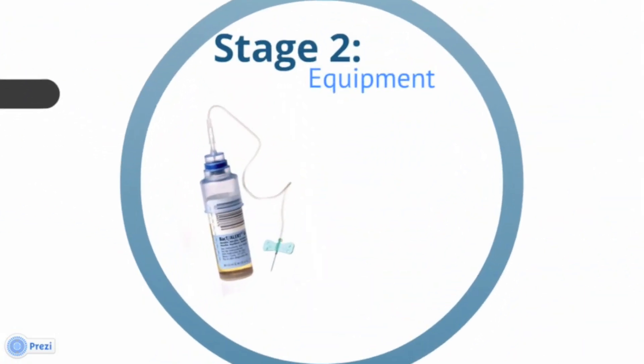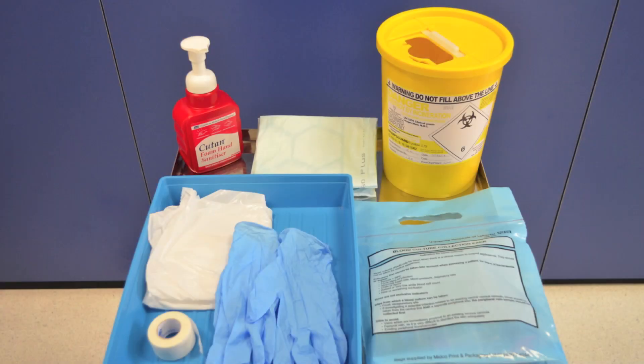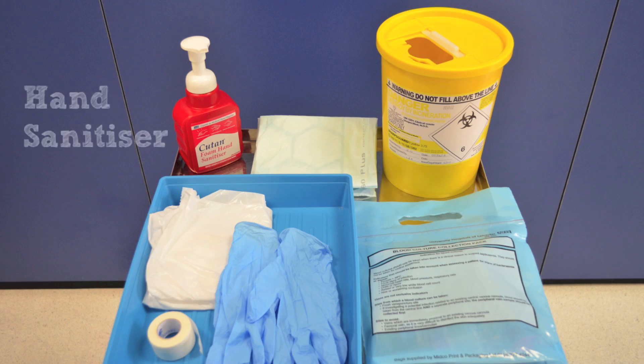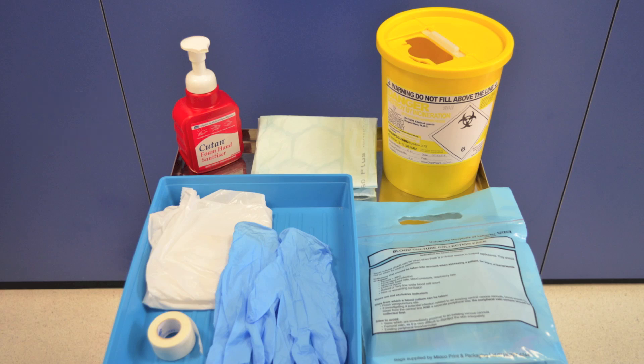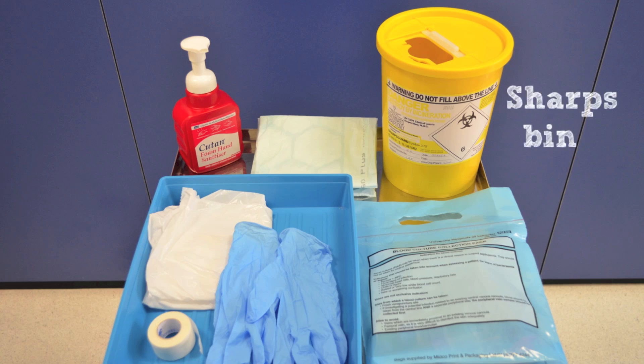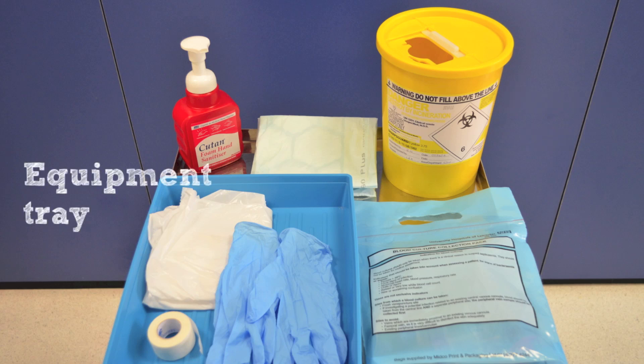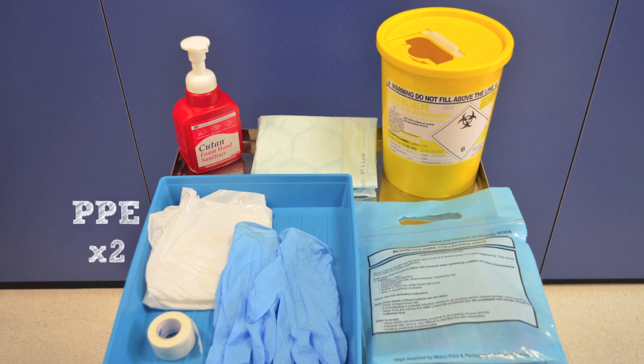Stage 2 requires you to gather the equipment for this procedure. The following items are needed for taking blood cultures: a trolley, hand sanitizer, an Incopad to protect the patient environment, a sharps bin, a high-sided plastic tray, two sets of non-sterile gloves and apron — one for cleaning your trolley and tray, the other as part of your personal protective equipment at the patient bedside. You may require goggles if you deem it to be appropriate.